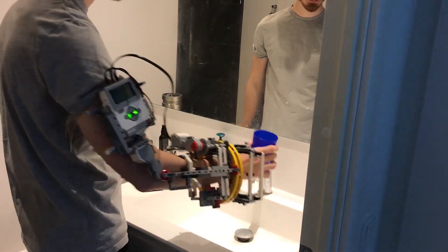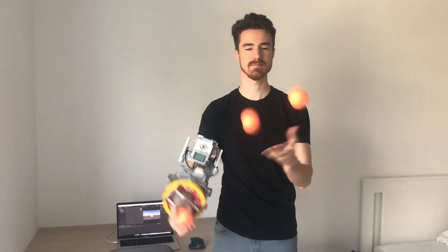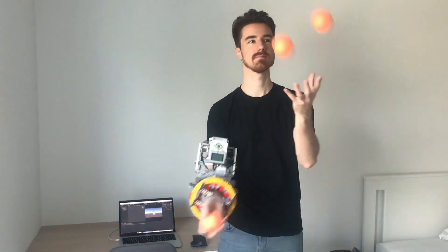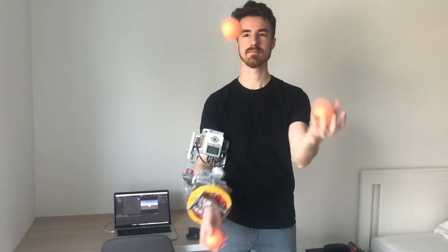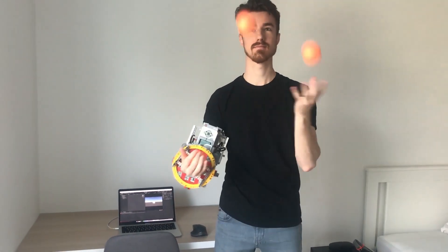We aim to design a novel solution to help stroke patients through hybrid rehabilitation to regain the ability to perform daily activities, and to perhaps enable the learning of new activities with assistance from an upper limb exoskeleton.